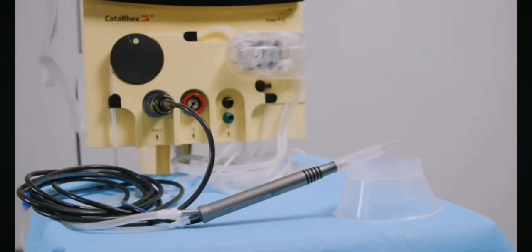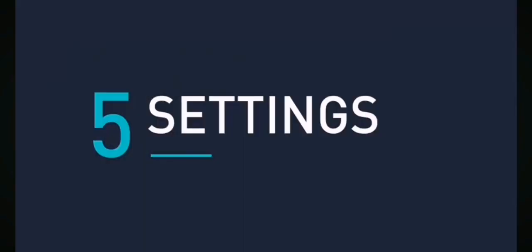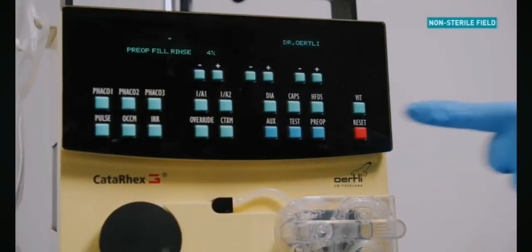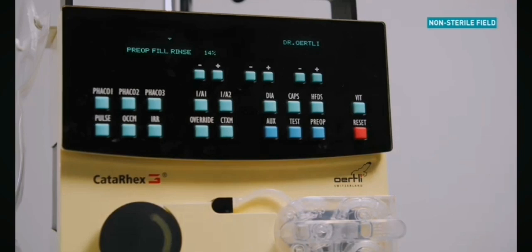Place the handpiece at a 45 degree angle to ensure optimal priming. Press the pre-op button to start the priming cycle. Allow the pre-op cycle to complete fully, approximately one minute.